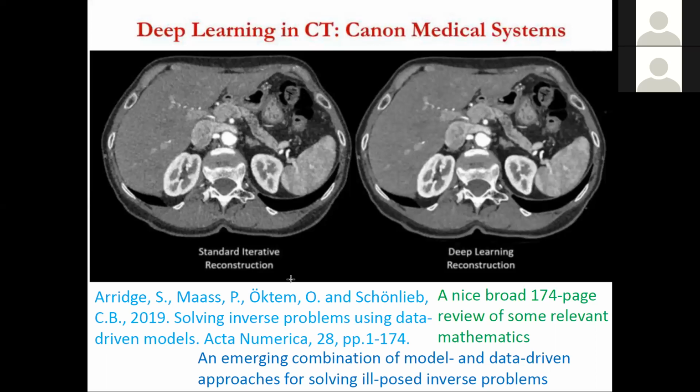So either way, you can make a synthetic image, particularly if you forward project this with a good model, that will look like the reconstructed image that you make from it. So when you do that, you can make it as if it had higher statistics. It'll still have the noise, but it'll have the right texture for the noise. You prefer to do that with real data, but there are other tricks you can do. And for PET, since you brought up PET, you have the natural thing there where you get list mode data and you just use a fraction of it.